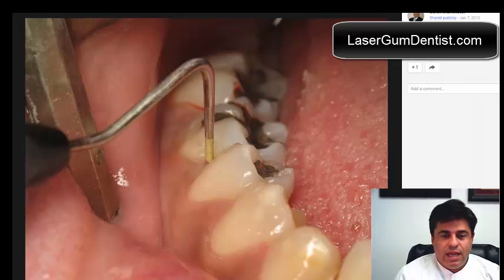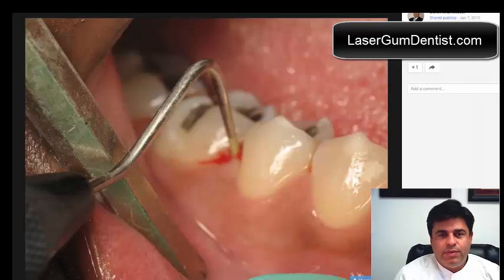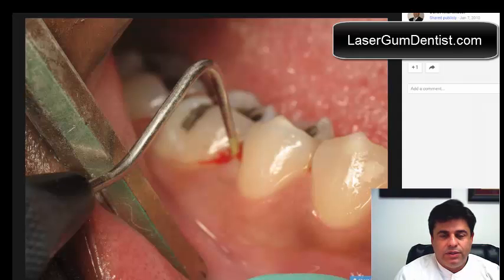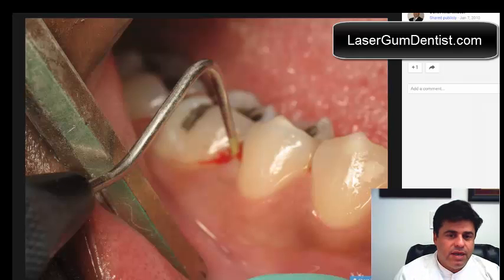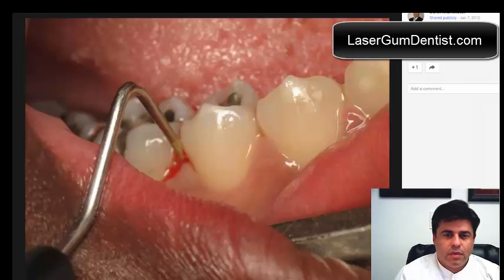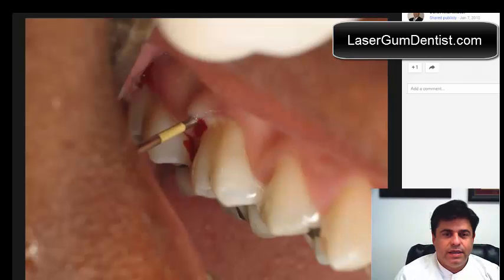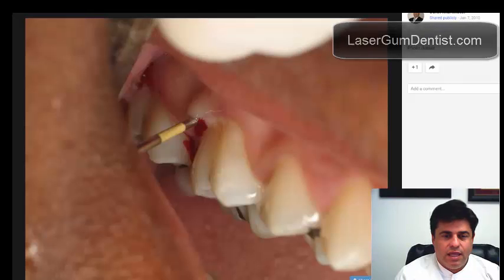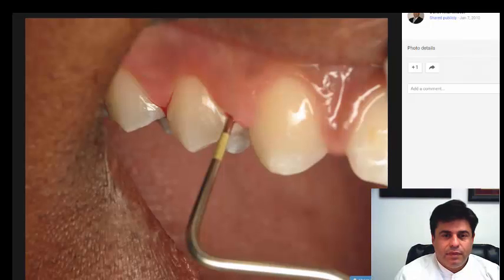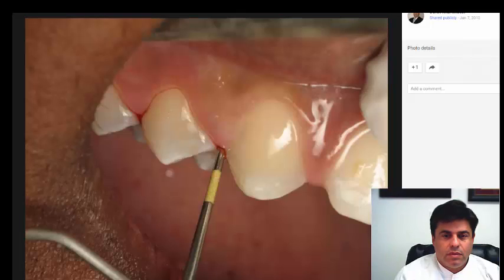Especially on the lower anterior segment. This is the periodontal probe that your dentist should be placing between your gum and your tooth. This measurement here is about nine-plus; at this line it would be 12 millimeters, down here nine, right where it disappears. Again the same tooth: nine-plus, bleeding on probing. This is the upper molars — this would be nine at this line, so about eight right there. You can see the separation in the pocket. The bicuspids also had some problems — seven millimeters, because there's a yellow line right up here that represents six; about seven millimeters.